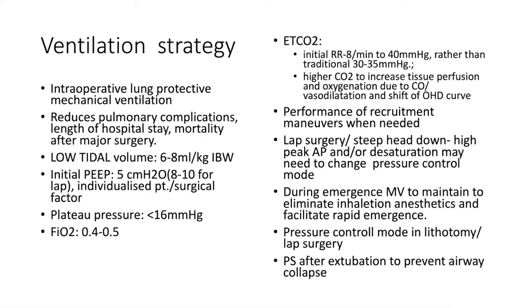In lap surgery and steep head down surgery, high peak airway pressure may happen. A patient may go into desaturation. So we may need to change the mode of ventilation to pressure control mode.